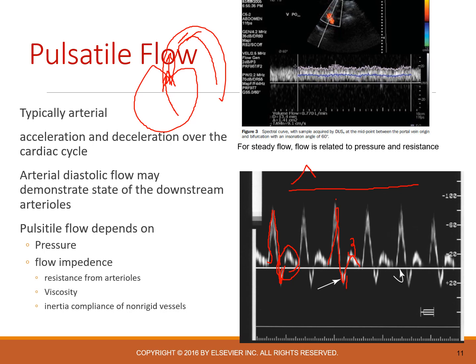So even during diastole, I'd get forward motion, granted at a much lower velocity, but forward motion nonetheless all the way until the next systole. At the end of systole, the forward motion is reduced, but because that organ wants the blood so much, it's going to have arterial dilatation, which allows the blood to just flow through with the motion it already has because of that very low resistance.